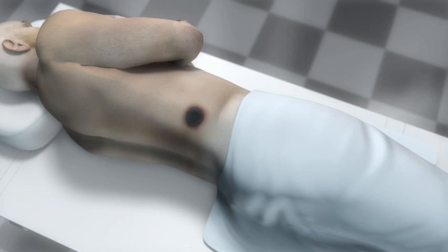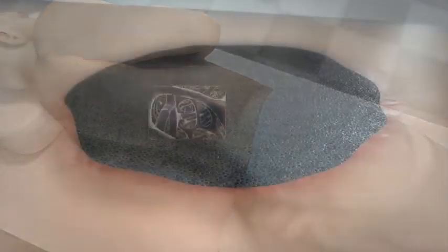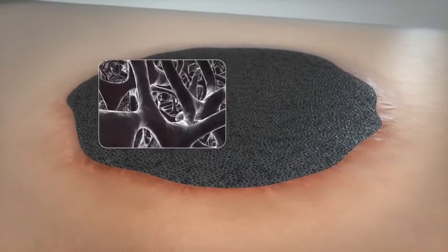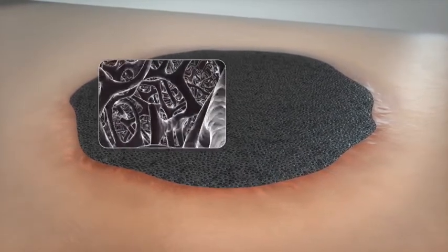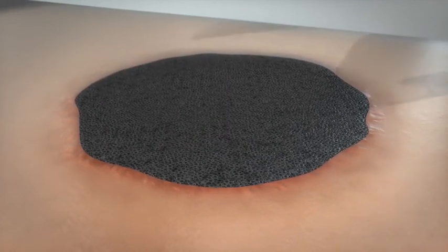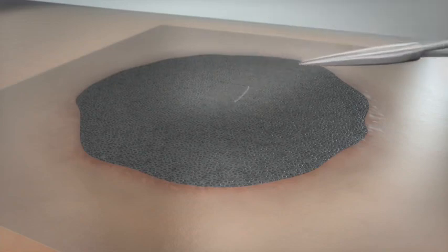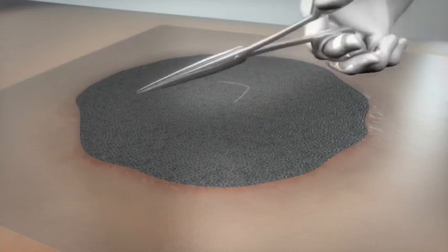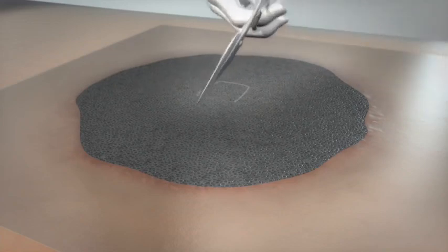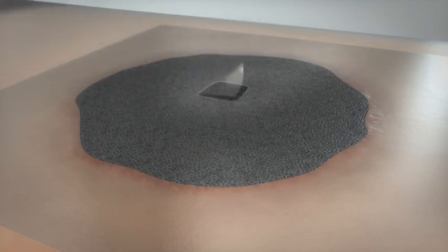When treating a wound using VAC therapy, the KCI proprietary granufoam dressing, which is a reticulated open cell foam, is placed directly into the wound bed. A semi-permeable drape is then used to seal the wound, provide a moist wound environment, and protect the wound from external contamination. The proprietary track pad and tubing are then applied to the drape and provide the connection to the therapy unit.